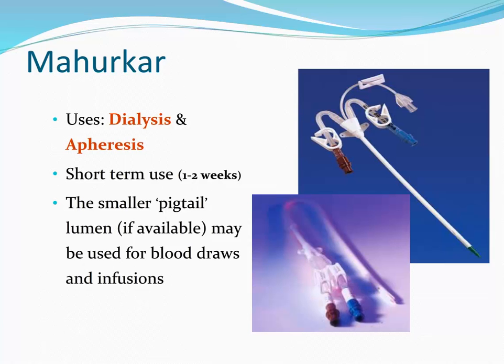After use, dialysis ports are flushed with normal saline and then impregnated with approximately 1 cc of heparin, concentration 1000 units per cc, to prevent clotting. Anytime you need to place heparin in the line, you will need a specific doctor's order. We are usually just doing the double check for dialysis nurses. However, if you are around supporting the placement of the line, once you have chest X-ray confirmation, you will need to flush the catheter and put heparin in the line.